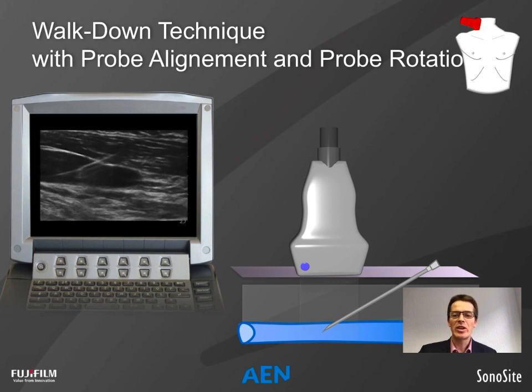But why don't you look at the guide wire while you insert it, because we all know the case that for some reason we get blood out of the vessel, but then can't insert the guide wire. So with ultrasound, you may easily visualize what the problem is. Either it is not inside the vessel, or it has actually gone through the posterior wall, or third option, something in the vessel is obstructing the guide wire, like thrombosis or something.